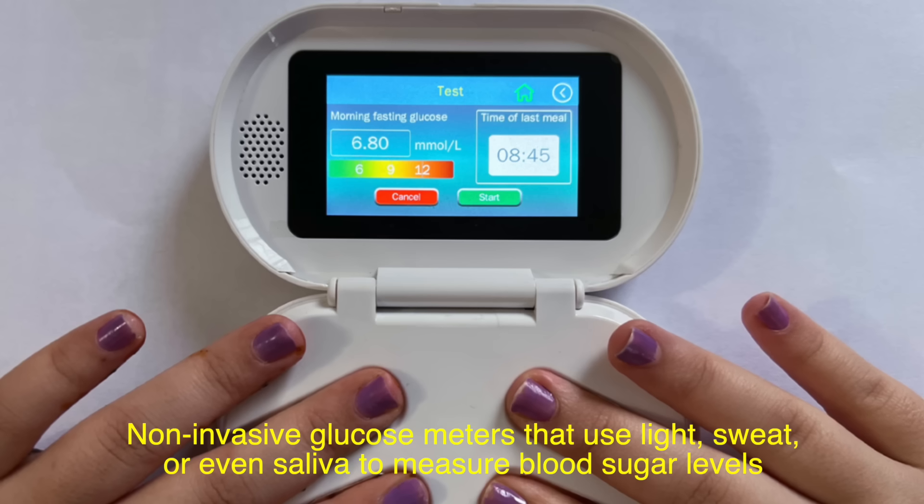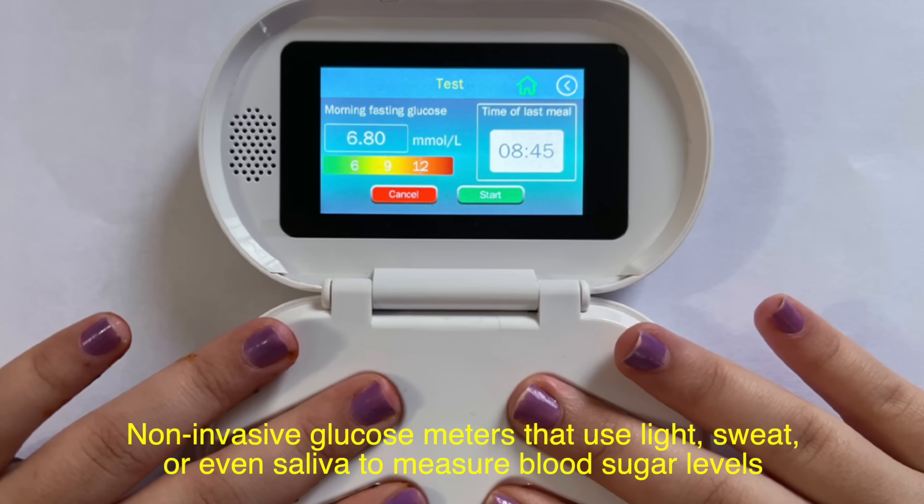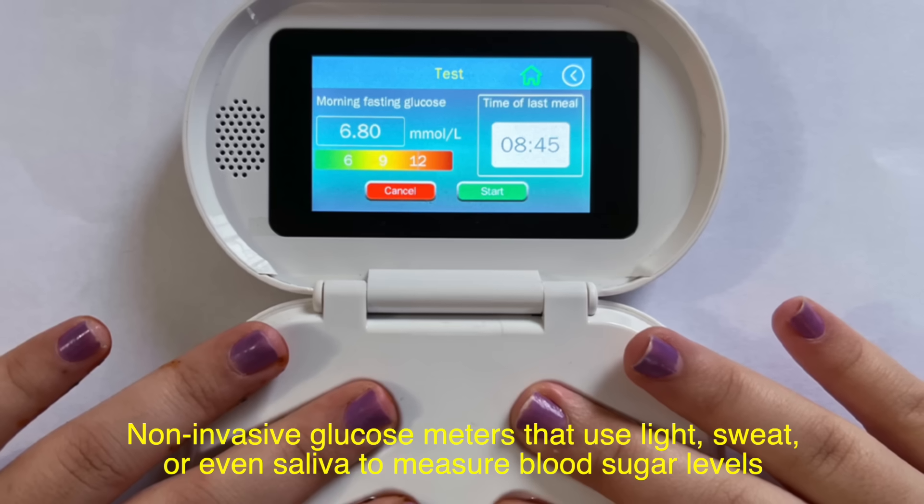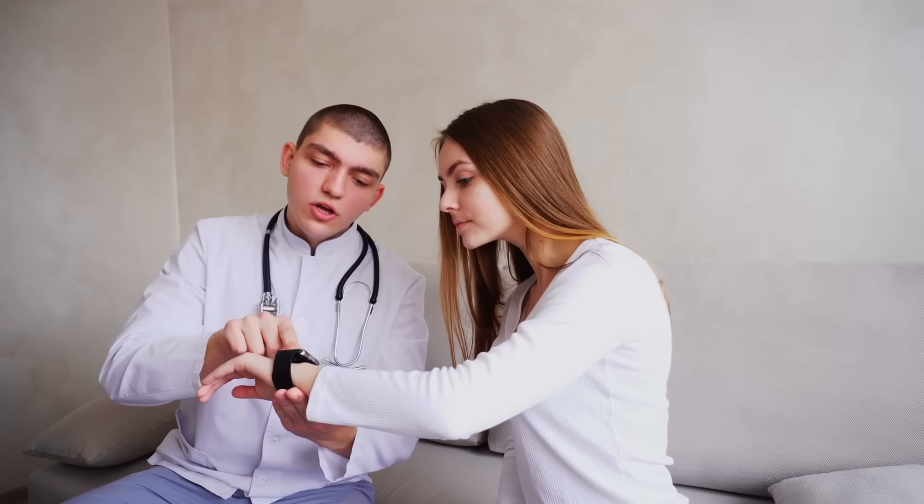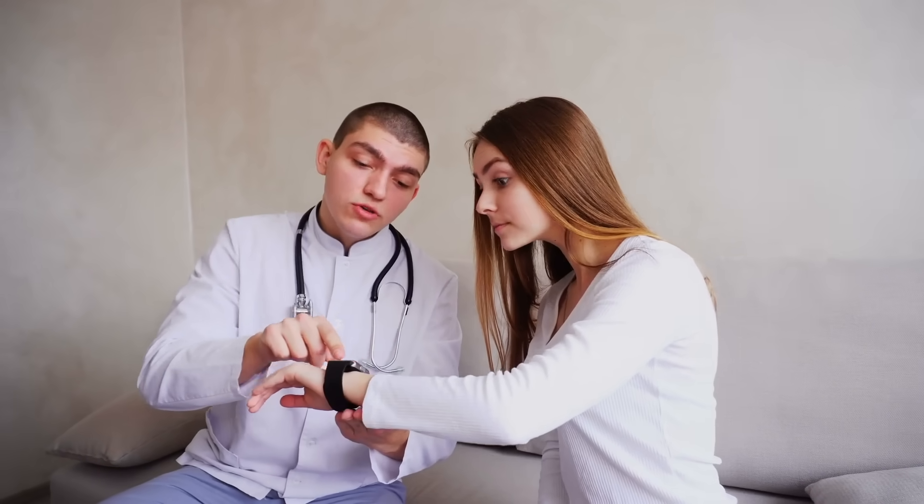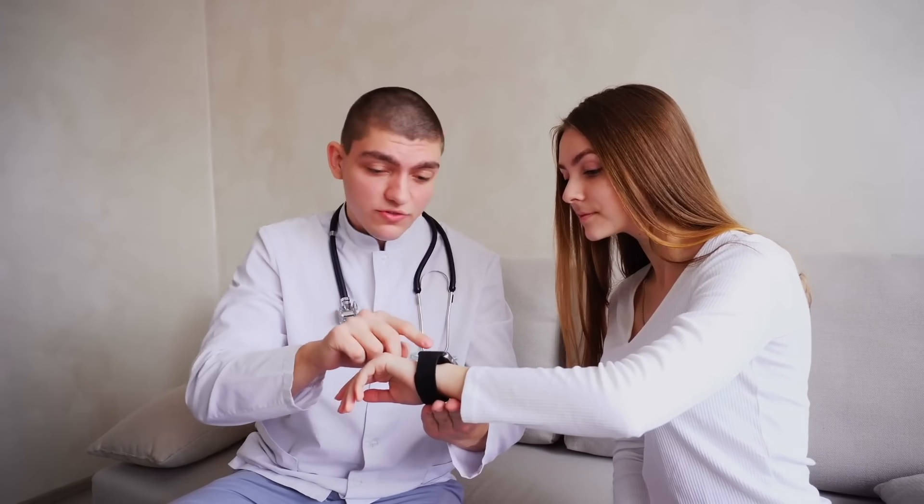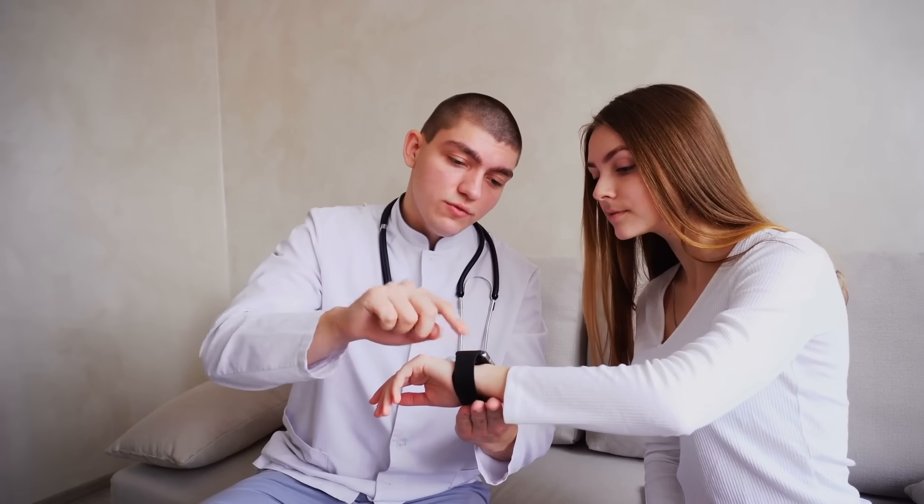The future of glucose monitoring looks promising. Researchers are working on non-invasive glucose meters that use light, sweat, or even saliva to measure blood sugar levels. Imagine a smartwatch that monitors your glucose without a single finger prick. These innovations could make managing diabetes even more seamless and less intrusive.